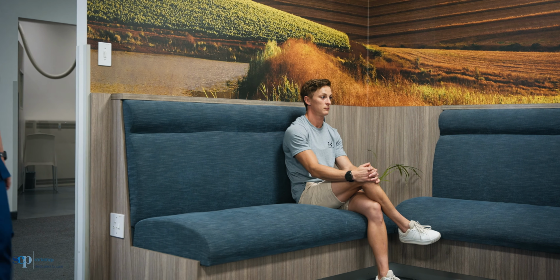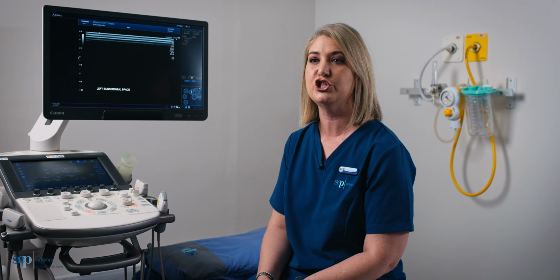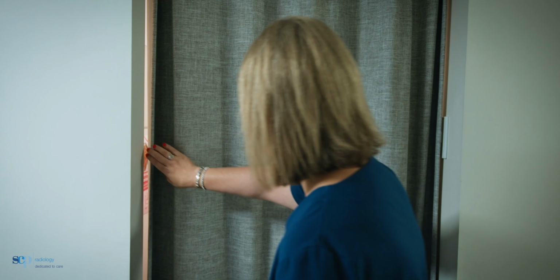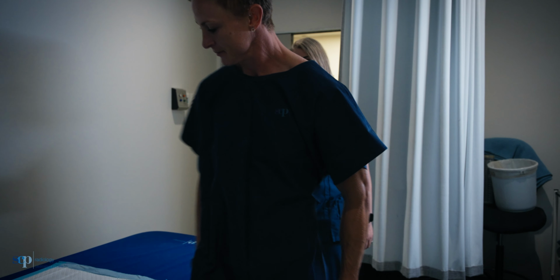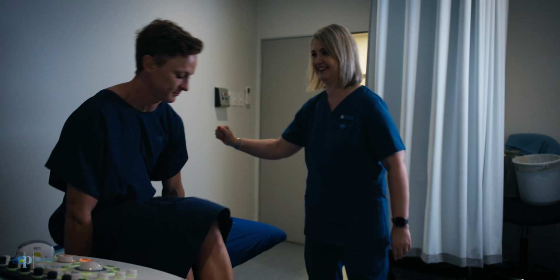So when the patient has arrived for this scan, we can see it on our system, and then I go to our front reception to meet the patient. And then we walk through to the changing rooms. The patient will then be asked to change into a hospital gown. From there, we will take the patient into the ultrasound room and explain what the procedure entails and what we expect of them.